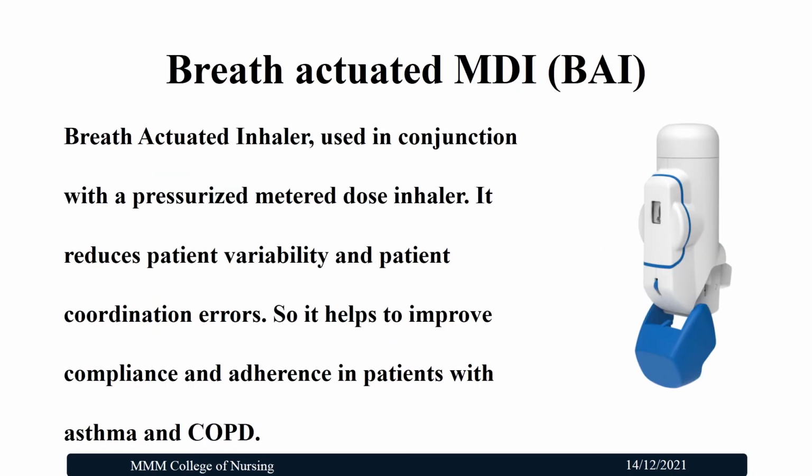Breath activated metered dose inhaler. It is used in conjunction with the pressurized metered dose inhaler. It reduces patient variability and patient coordination errors. So it helps to improve compliance and adherence in patients with asthma and chronic obstructive pulmonary disease.